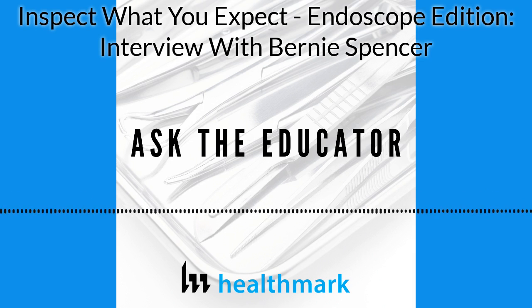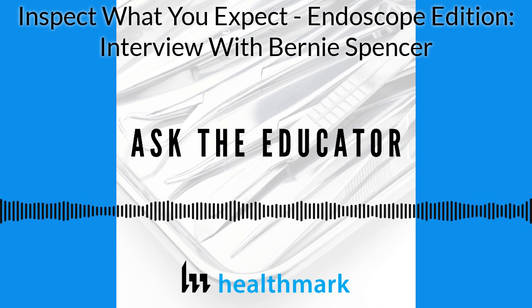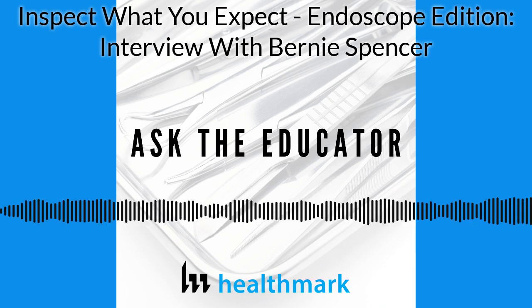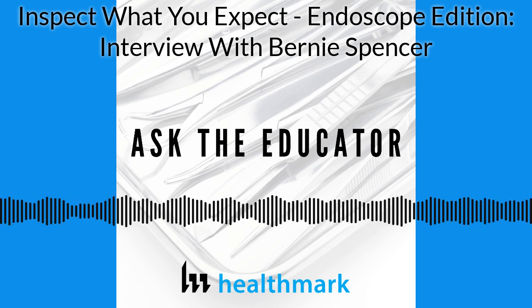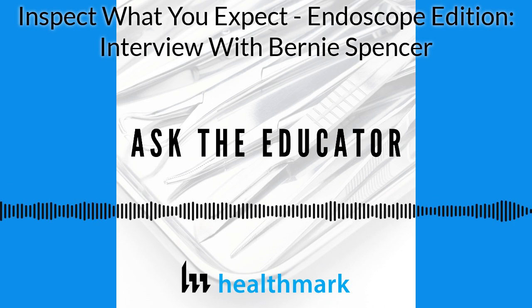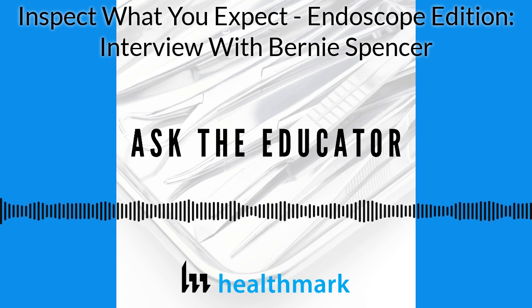Can I just stop you for 1 second, Bernie? So all of these endoscopes that you tested, were they manually cleaned by yourself, or were there other staff involved as well? Initially during the study, they were cleaned by myself for probably the first 300 or 400 studies that we did. And we tried various things. We tried different brushes. We tried different detergents, injected another cleaning person into the mix to see if there was a difference between how I cleaned versus the other person.